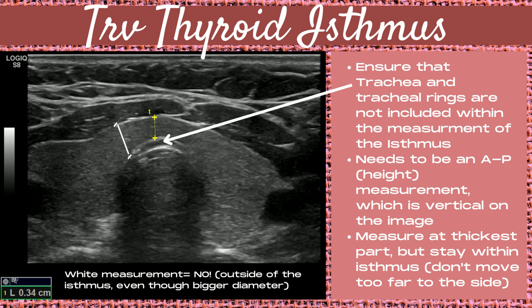Take an AP or height measurement of the thyroid isthmus in the transverse plane. Ensure that the trachea and the tracheal rings are not included within the measurement. The white arrow in this diagram points to the trachea, and right below that is a bright white hyperechoic line — that's a tracheal ring. Neither of these should be included in the measurement. You want a vertical height measurement, measured at the thickest part of the isthmus, but stay within the isthmus. Don't move too far to the side or you're no longer in the isthmus.